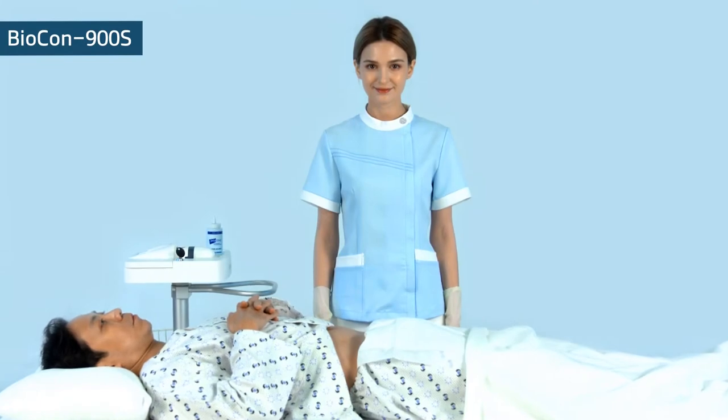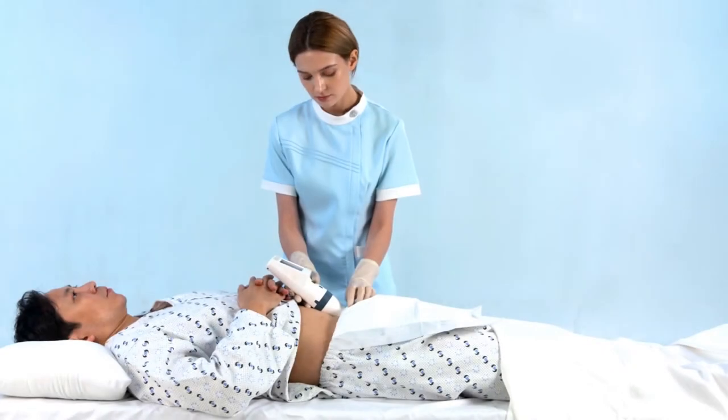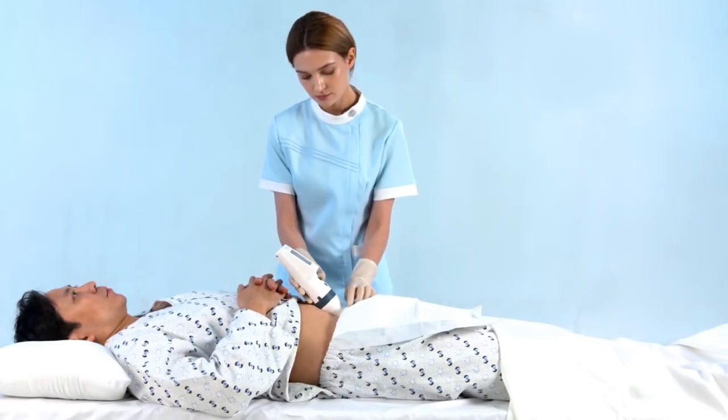Let's take a look at how to use the Biocon 900S. Make sure the patient lies in the supine position.